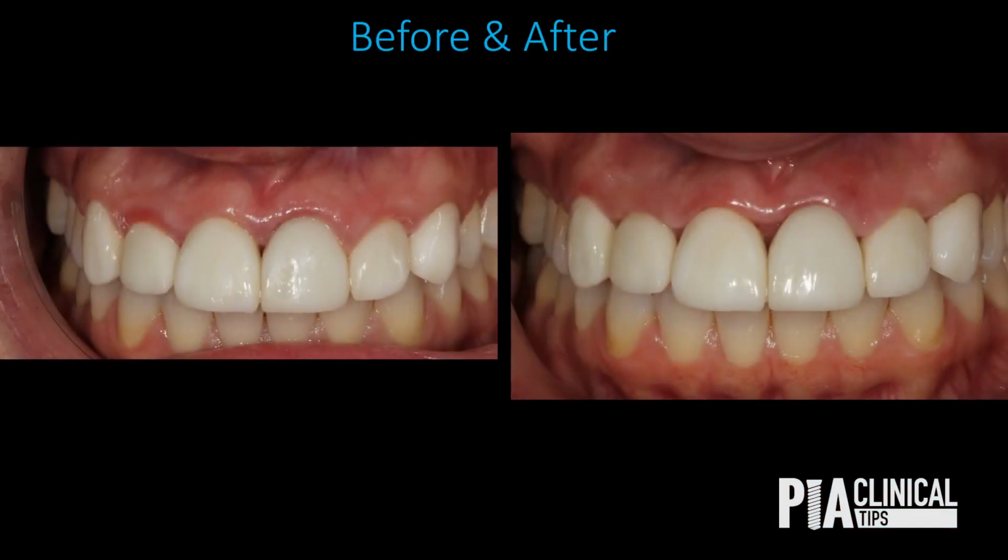If you take a look at the before and after, you can again see inflammation from the invasion of biologic width in the before shot, and after, again, a nice tissue tone whereby the tissue will accept new crown restorations and new veneer restorations with that nice biologic width created.